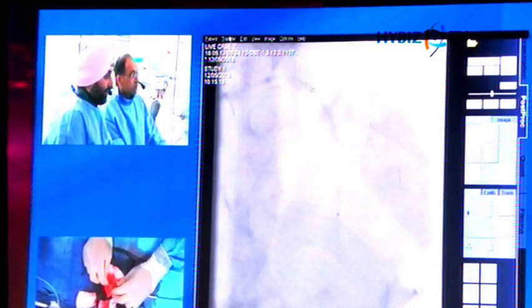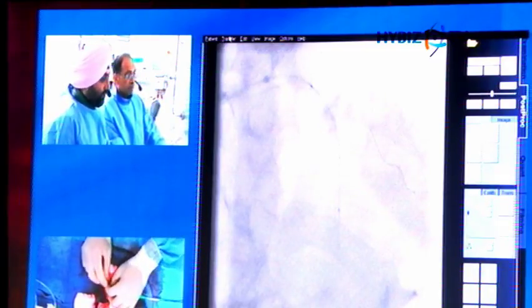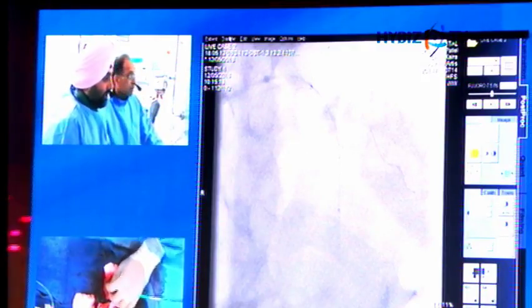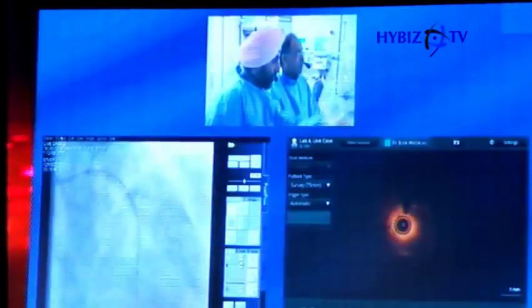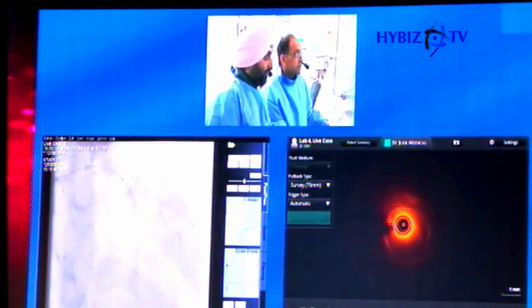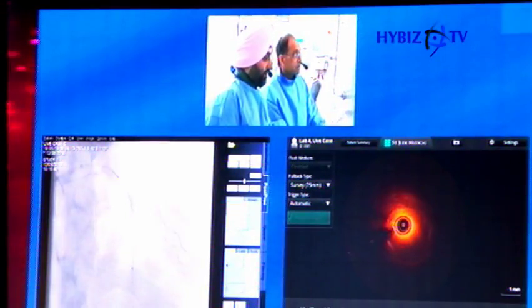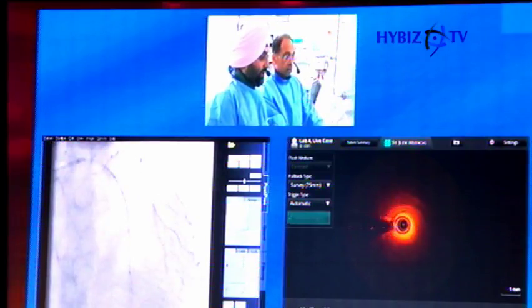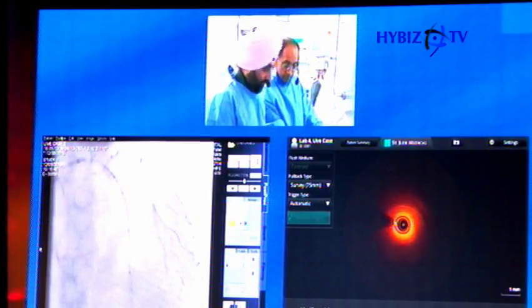Okay. Fine. So 15 frames per second, please. You'll just come back beyond, just go forward a bit, Devon. Okay, just confirm the guide's engaged properly. Okay, so let's just do a test clearance there. Yeah, we've got good clearance there. Okay, ready to run. So 15 frames, I'll tell you when, Devon.